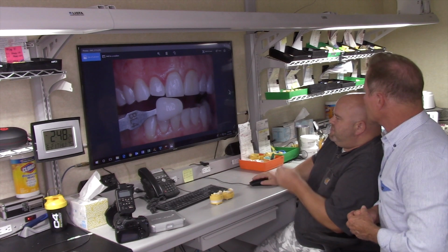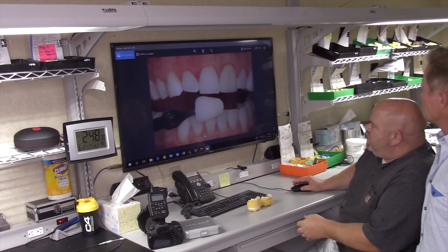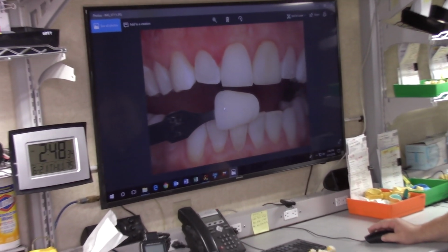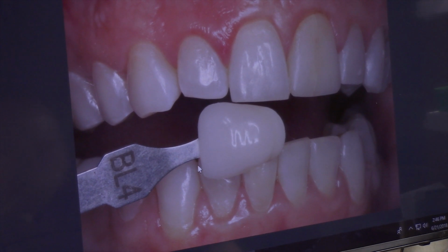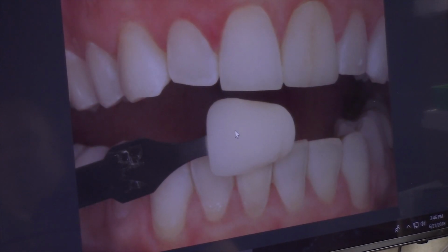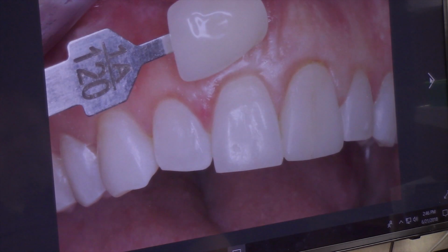Yeah, this is a neat photo, because in this picture the shade tab actually looks warmer than the tooth. But when you jump to the polarized, you can see that it's actually a lot closer than what it looks like. So a lot of times we really trust the dentist in picking the shade tabs, and we'll get photos that don't necessarily match the tooth. So this is just another way that we can double check and make sure that we're on the right path, having a polarizing lens.